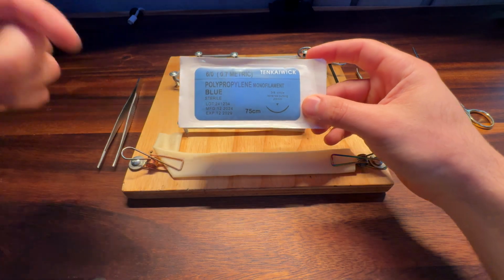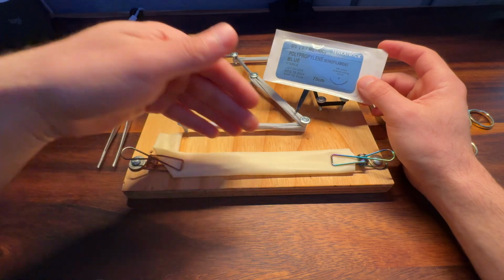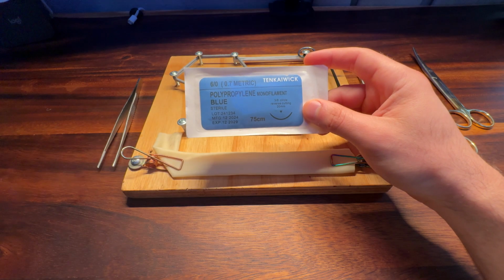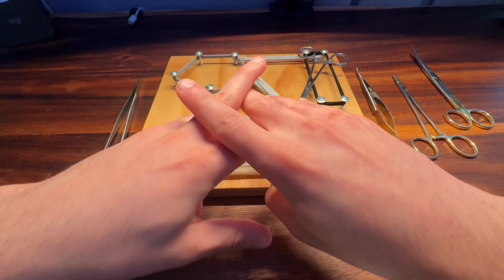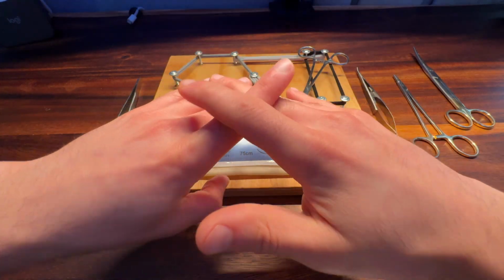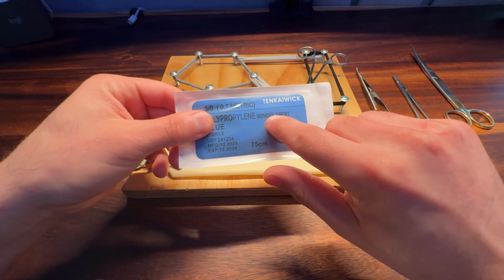Whenever you're choosing a suture for anything that involves connecting blood vessels, you want, first of all, a monofilament, okay? Because the braided types of sutures are kind of intertwined like this, and whenever you're passing the suture through the blood vessel, that weaving creates a lot of friction and it could damage the vessel. So that's why you want, first of all, monofilament.